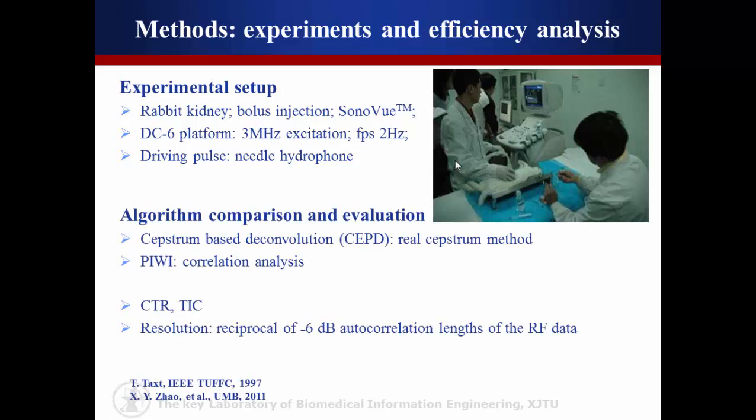To demonstrate the efficiency of the proposed BED, cepstrum-based deconvolution and PIWI were also performed as comparisons. Cepstrum-based deconvolution is an improved deconvolution method, where the PSF was estimated by homomorphic analysis, and the real cepstrum method was used here.